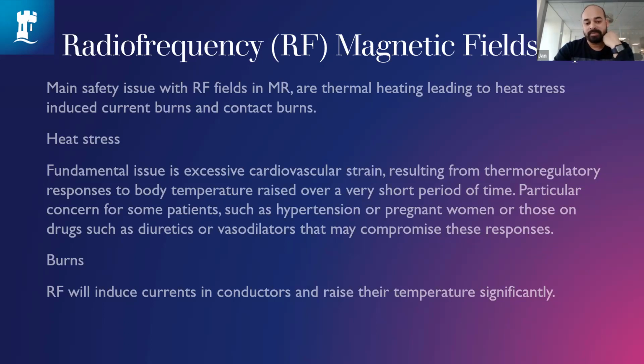Since then we have changed the method, and instead of just having paper clothes there, we added more padding to reduce such an event happening again. But there are real things that happen due to the RF pulse.